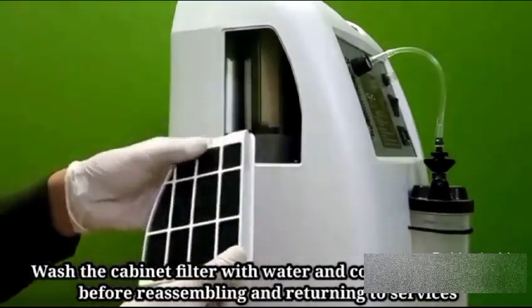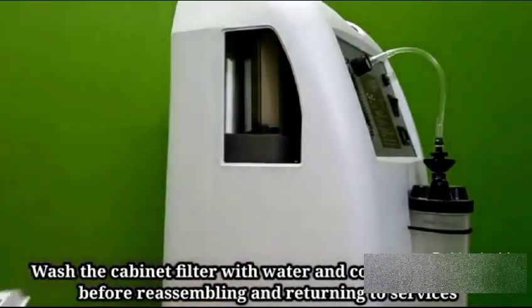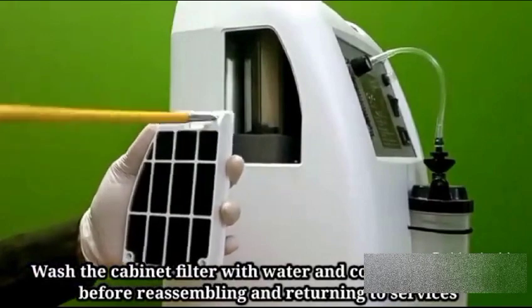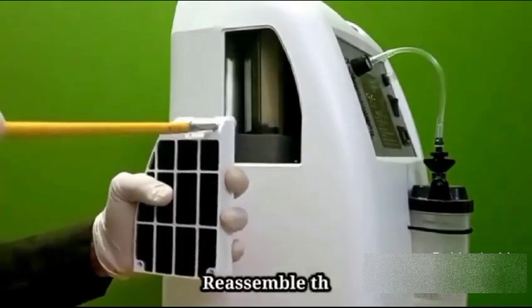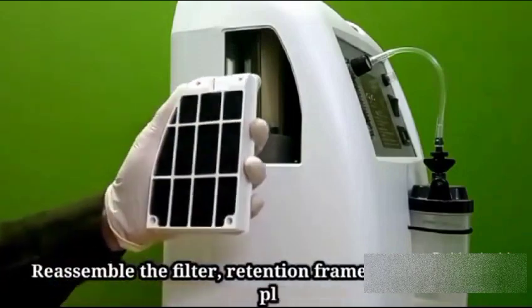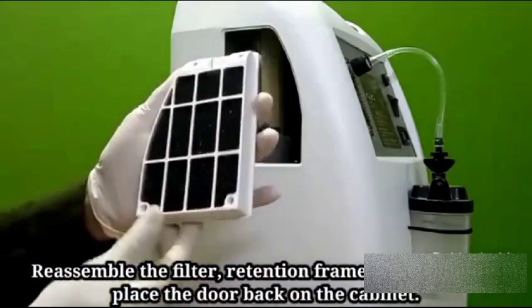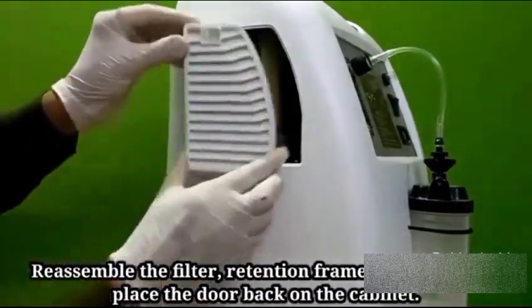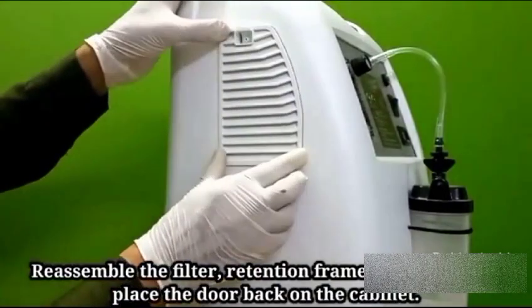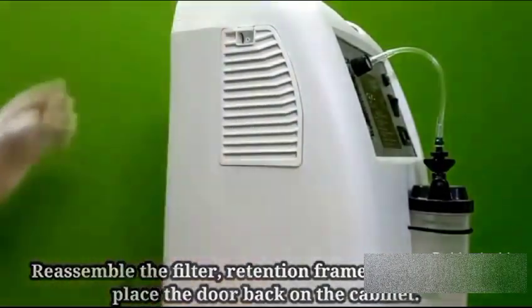As you can see, here you need to apply the screw. Tighten the screw. And after tightening the screw, it will be fitted back in its place. You will fit this here, fit it from the bottom first, then press it on top. As you press, it will fit in the frame.